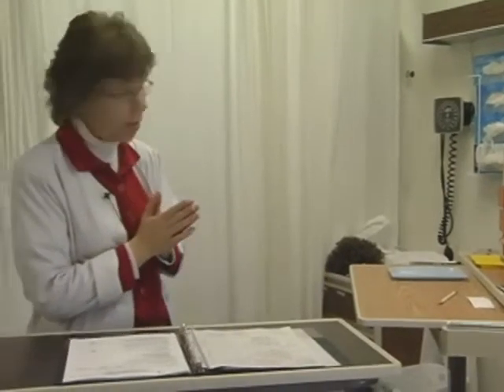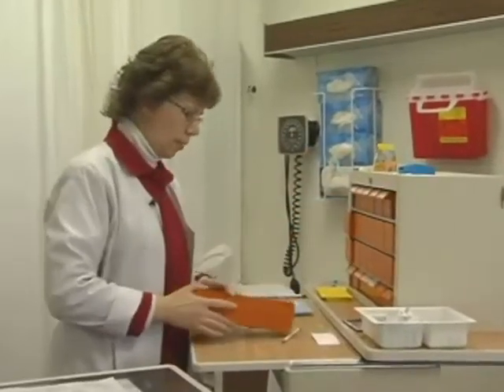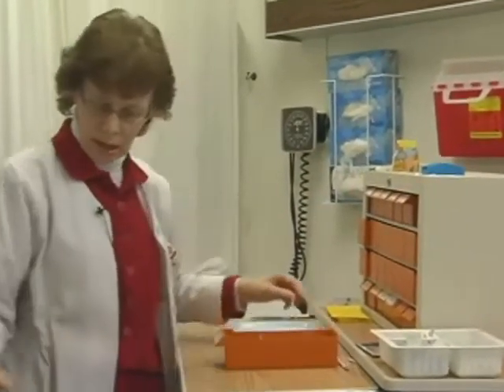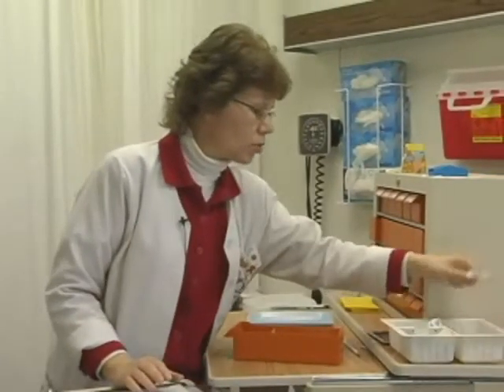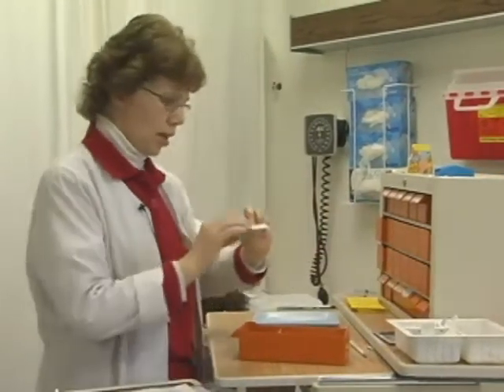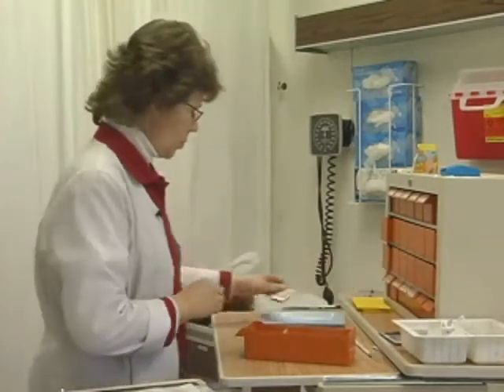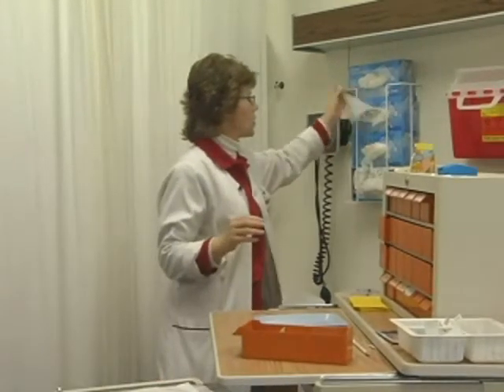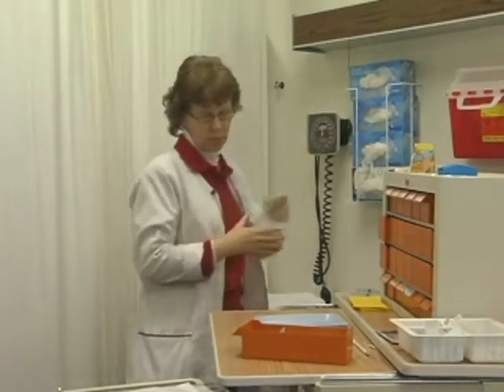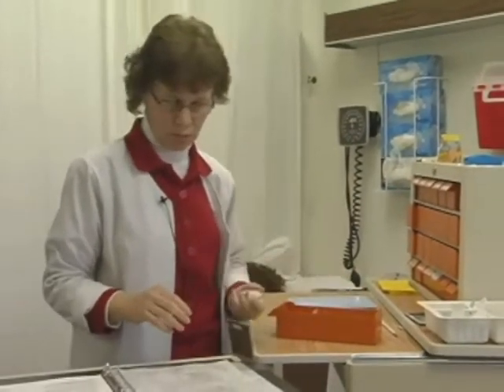Okay. And I'm going to wash my hands before I get to my equipment and then start to gather my equipment. So I need Harmon's drawer, and I'm giving a medication, so I'm going to need a syringe and an adapter. I'll need some alcohol. Need some gloves. And I need my medication.